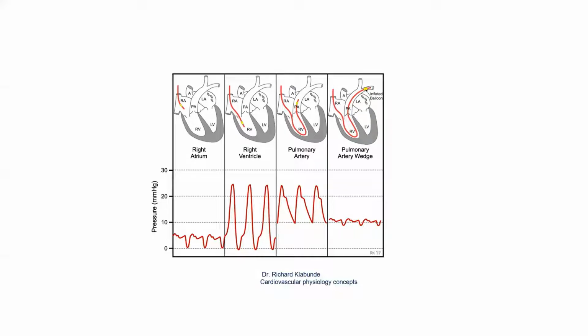The pulmonary artery and the wedge, exactly. Because as you go here, this is kind of automatic, spontaneous. You are pushing down and it goes to the RV, it goes to the pulmonary artery. But when you wedge, are you wedging in the right place or not? That is the problem. So sometimes you need to make sure that you are wedging in the right site. This is probably the most critical step of the Swan-Ganz.